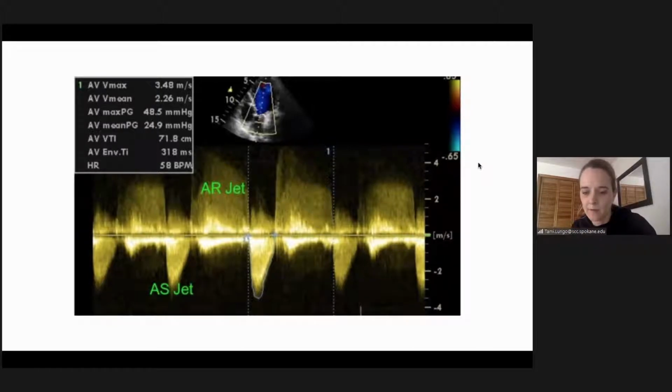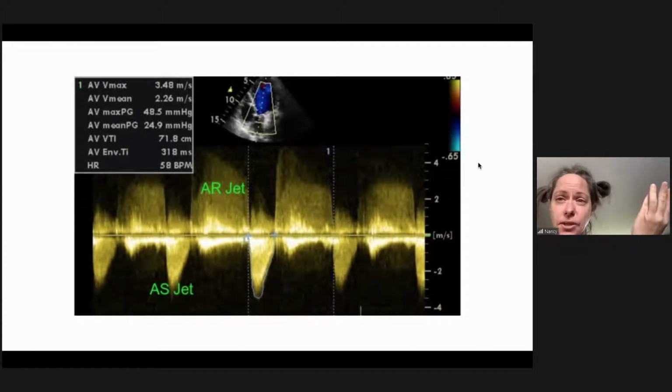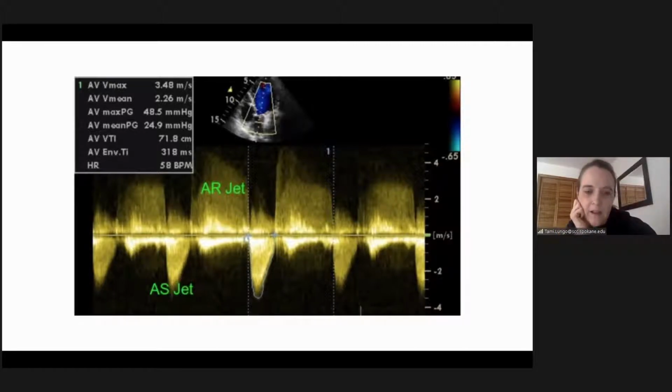I'll pull it up. I would appreciate that, but before we leave this slide, is it overgained maybe and then over measured on the bottom? It does look over measured there. And the thing that's really hard, and this is why when Tyler critiques you guys it's kind of brutal, is that on the machine it looks different than how it comes over on the reader.